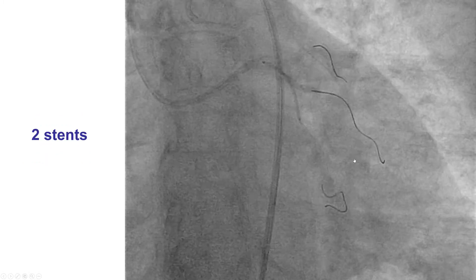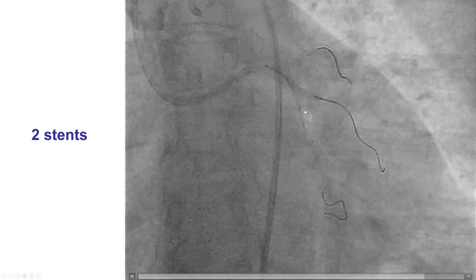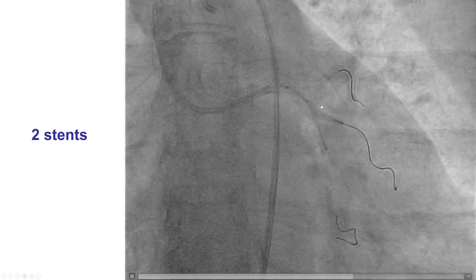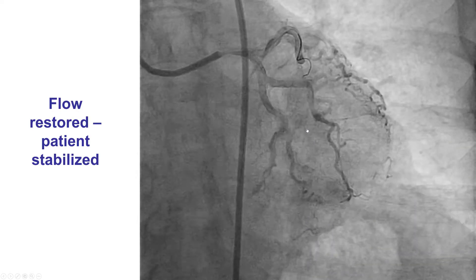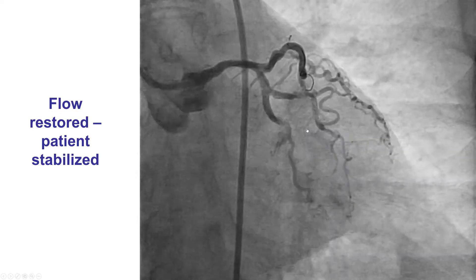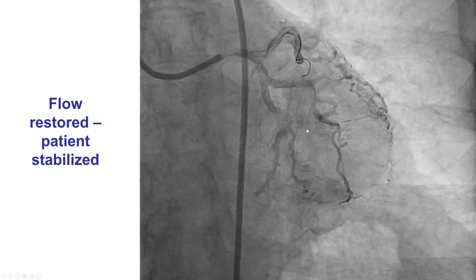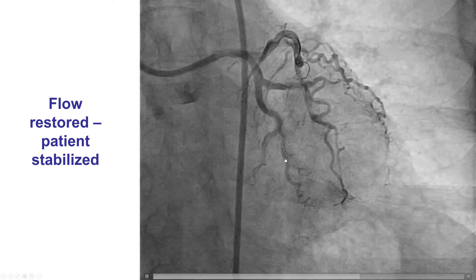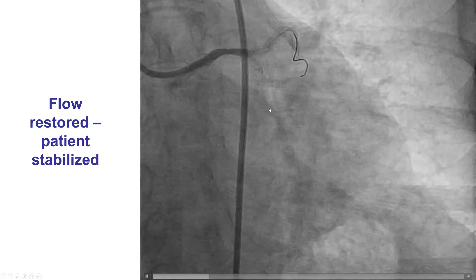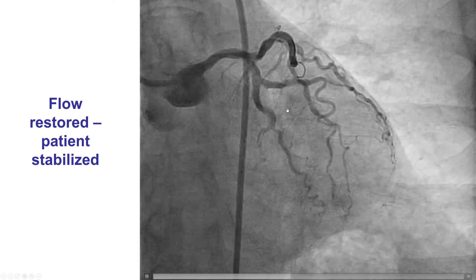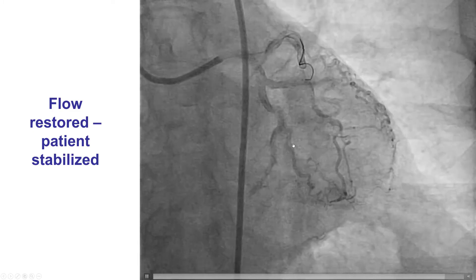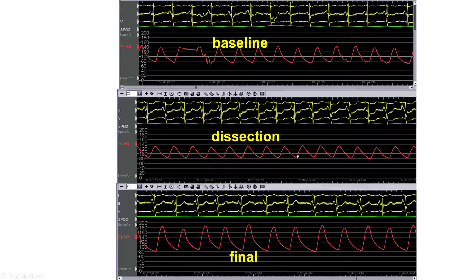We ended up having to use two stents because of residual dissection in both the obtuse marginal and the distal circumflex. Finally, after significant difficulty delivering, we were able to restore flow in both the first obtuse marginal and the distal circumflex. There appeared to be some residual dissection distally, but flow was preserved. Therefore, we decided not to perform further percutaneous coronary intervention attempts. The patient's EKG changes normalized and chest pain resolved.